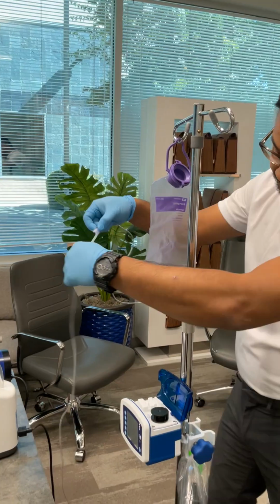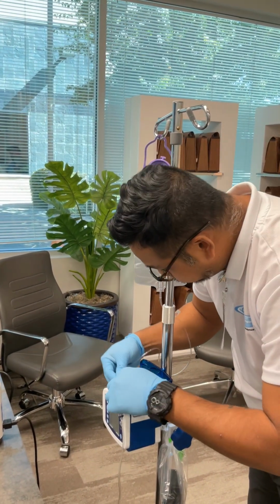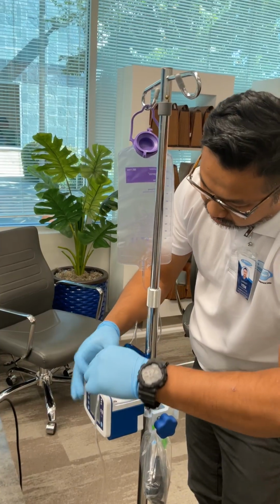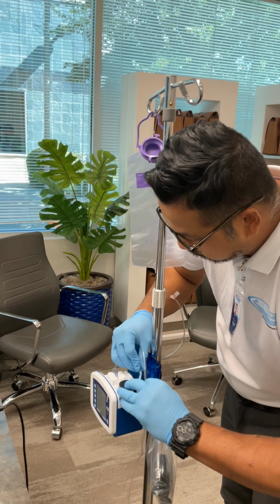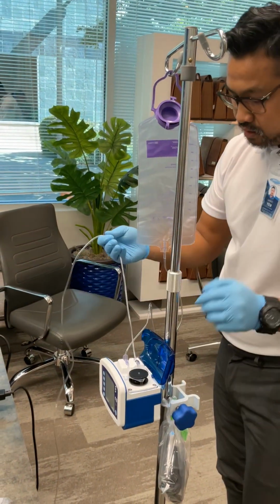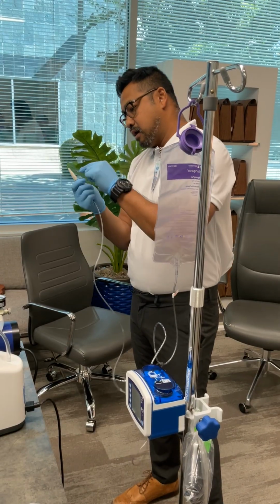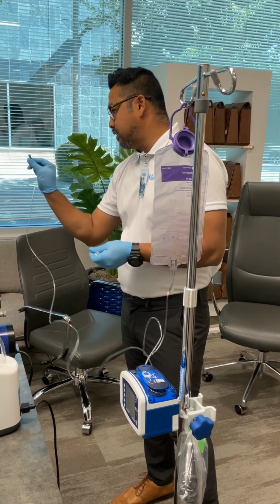So what you want to do with this one, the tab faces up, you insert it from here, and you insert it that way. You stretch the silicone hose around this wheel, like that, and then you'll settle it into this other groove right here. And then the cap would close down like that. And then the other end, of course, there is a sheath right here. There is a reduced end right here. You can twist that off and also have this piece.